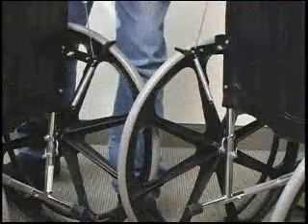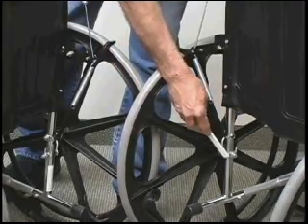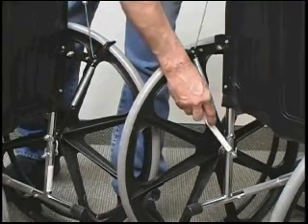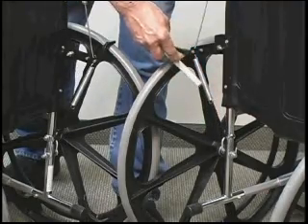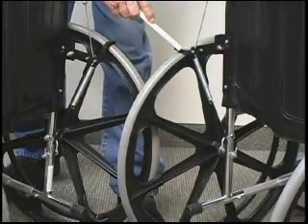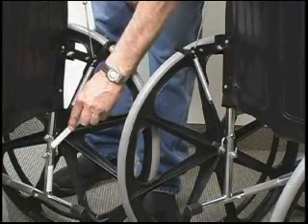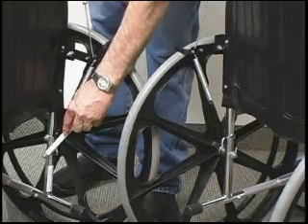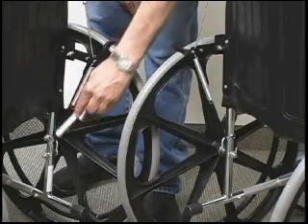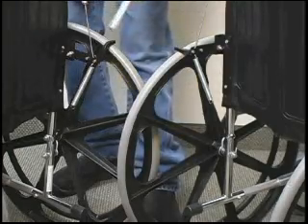When set at standard height, the brake system will appear as shown at the right of the screen. Anchor hook attached to the wheel bolt, tension spring adjustment strap, tension spring, and brake shoe. When set at hemi height, the brake system will appear as shown at the left of the screen. Anchor hook attached to the anchor bolt positioned in the lower hole, spring tension adjustment strap, spring, and hemi height brake shoe.